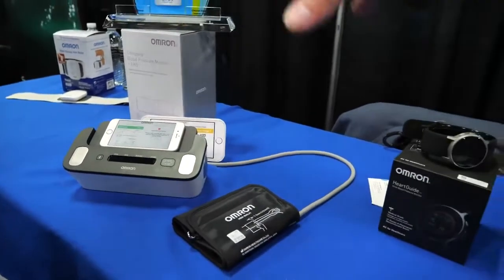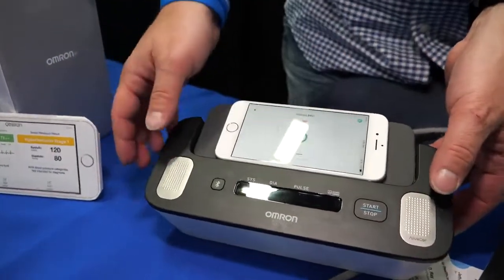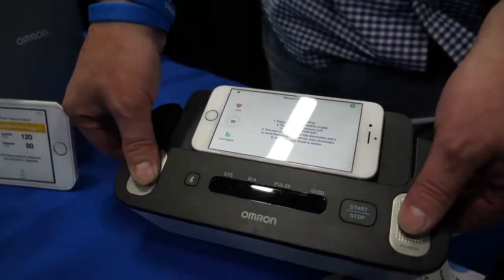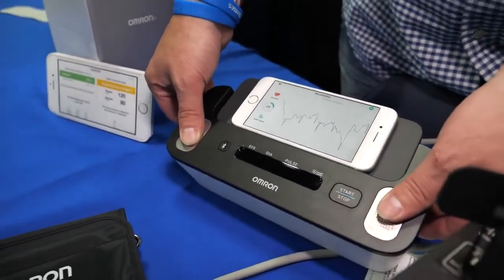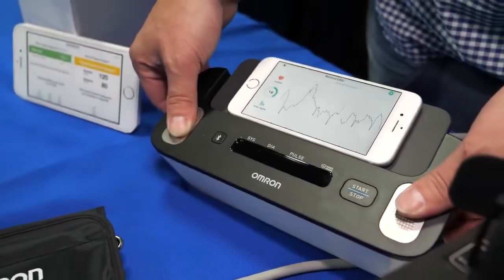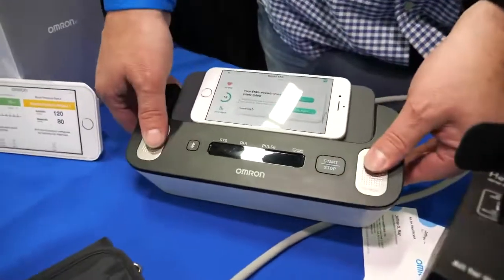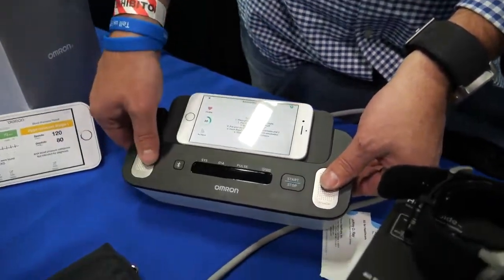The larger device is the Omron Complete — the first blood pressure monitor with both blood pressure monitoring and EKG built in. When taking blood pressure, placing fingers on the EKG pad simultaneously provides an EKG reading similar to what a doctor would use in their office. This is also FDA cleared. It's a partnership with AliveCor — AliveCor handles the EKG algorithm and interpretation, while Omron handles the blood pressure component.